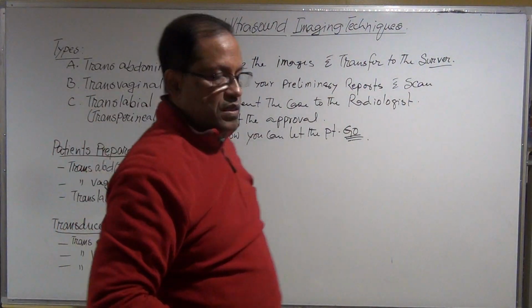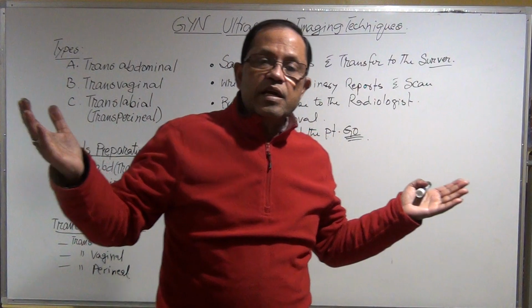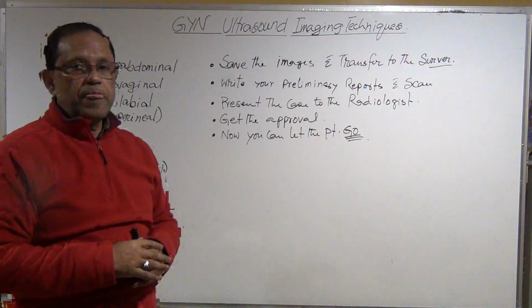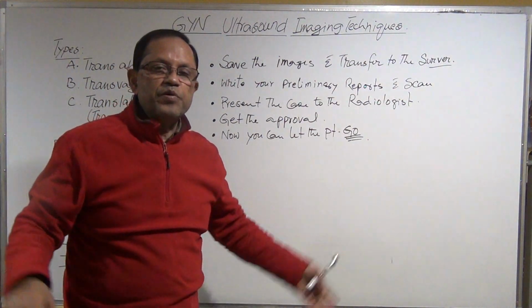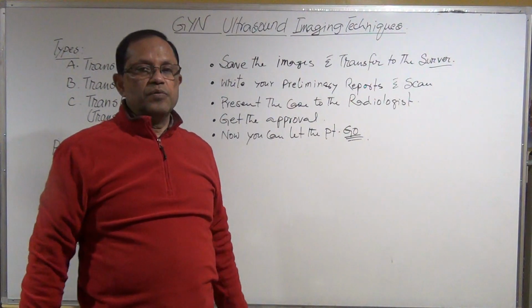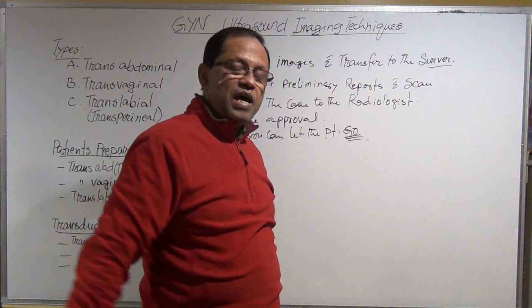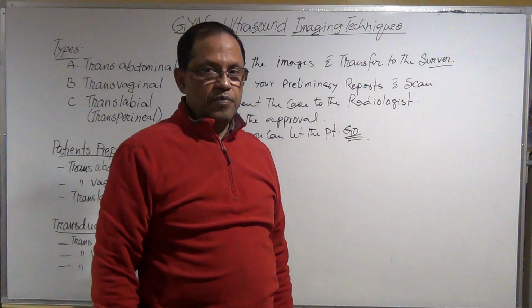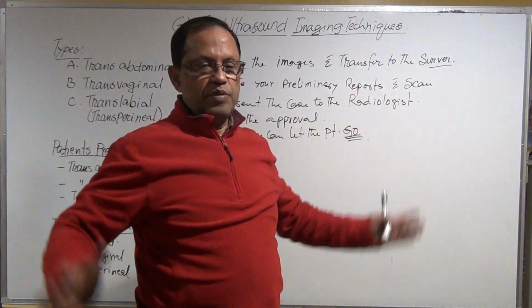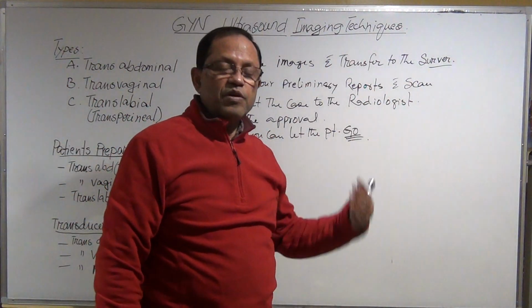This go means the patient was in your room while you were with the radiologist. Now you can ask the patient, okay, now you can dress up, but if the patient cannot clean themselves, you have to help them. Okay, so then the patient will get up, will be refreshed, and will say thank you, and will go home.